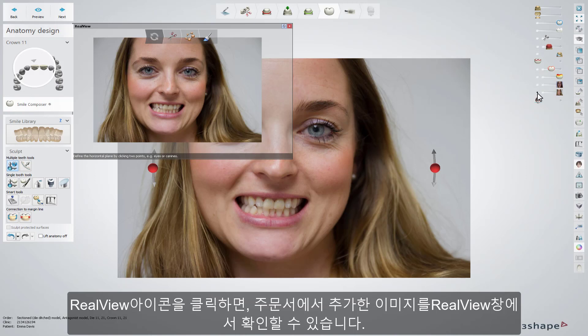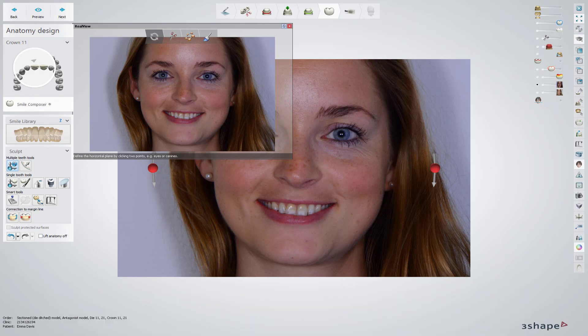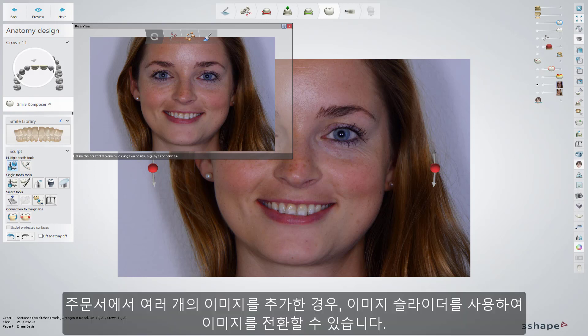When you click the RealView Engine icon, the RealView Wizard appears with the 2D image that you have already added in the order form. If you have not added any pictures, clicking the icon will open the Browse dialog, offering you to upload 2D images from a selected folder. If several images were added to the order, you can switch between them using the patient image sliders.